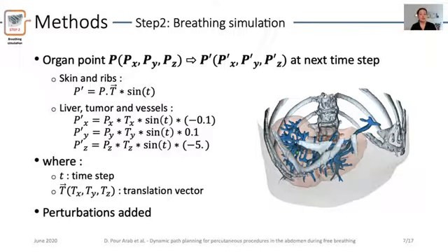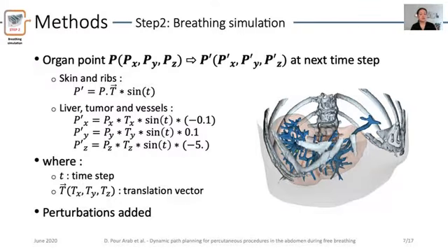To evaluate our trajectory planning methods in a more realistic setup, we also introduced perturbations in the cyclic motion to break its uniformity. It is important to note here that this animation is computed separately from the dynamic planning that we're going to detail. The planning is constantly discovering the motions, as it would be the case if we were tracking the anatomy of a patient.